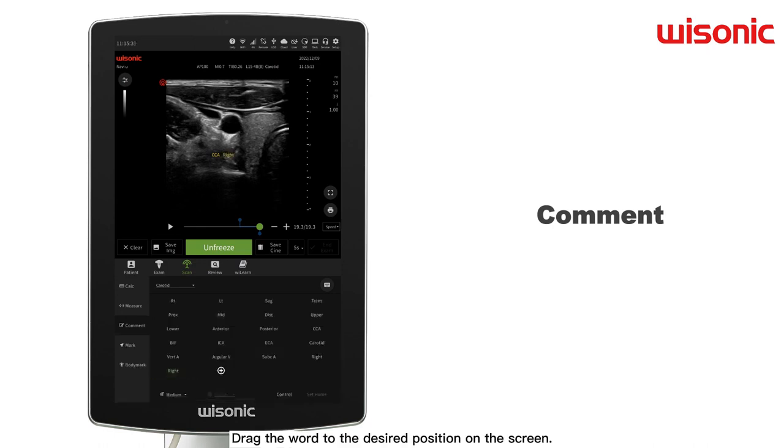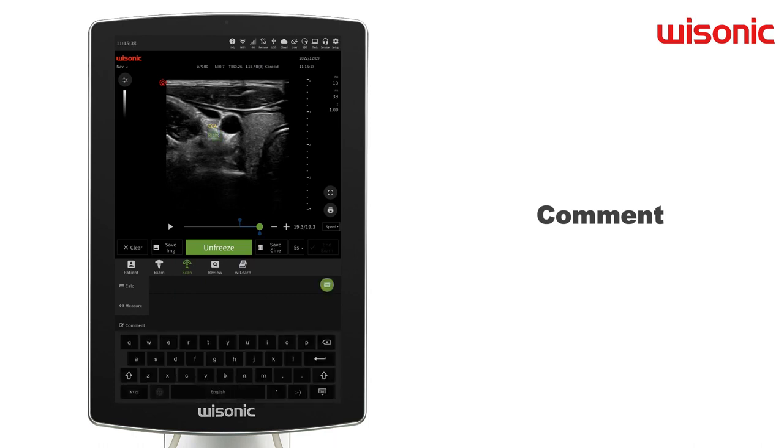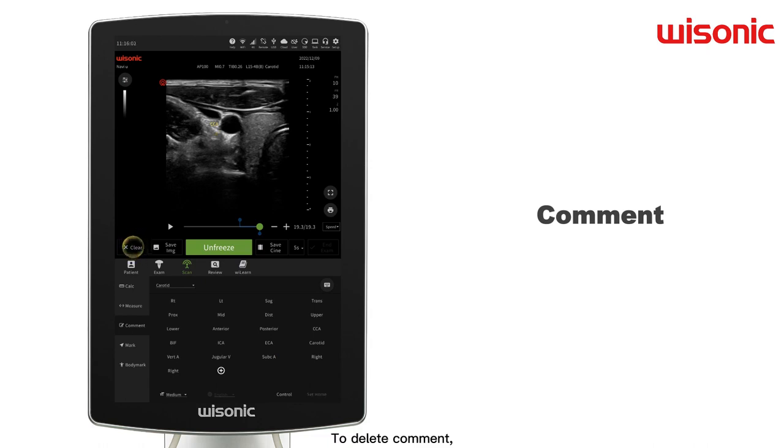Drag the words to the desired position on the screen. Tap on the word to edit. To delete comments, click Clear to delete the last added comment, or long press Clear to delete all the comments.